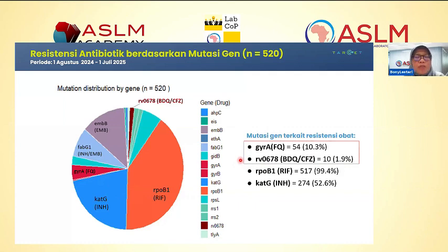So we also find discrepancies. Sometimes we have rifampicin resistance by Ultra, but when we run tNGS, the result is sensitive. So it sometimes becomes a conflict for the clinician, because this patient is showing rifampicin resistance by Ultra, but your tNGS is sensitive. The patient needs to be treated anyway according to our guidelines. So we are also thinking we need another modality for diagnosis. We are thinking of WGS for this kind of patient for further confirmation. So this is the result we have.